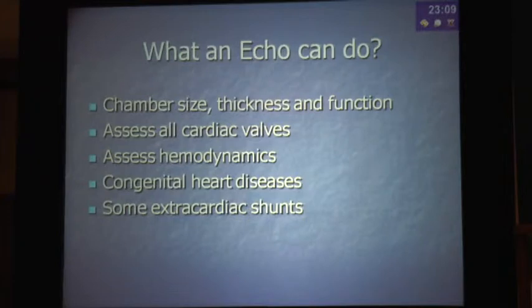What an echo can do, how can it help us? Basically, for every myocardial infarction in an angina patient, it helps us determine the chamber size, thickness, and function. Thickness, it helps us in our hypertensive patients to see for left ventricular hypertrophy. Chamber size to diagnose dilated cardiomyopathy, and function to see for LV dysfunction, post-myocardial infarction, or in idiopathic cardiomyopathies.